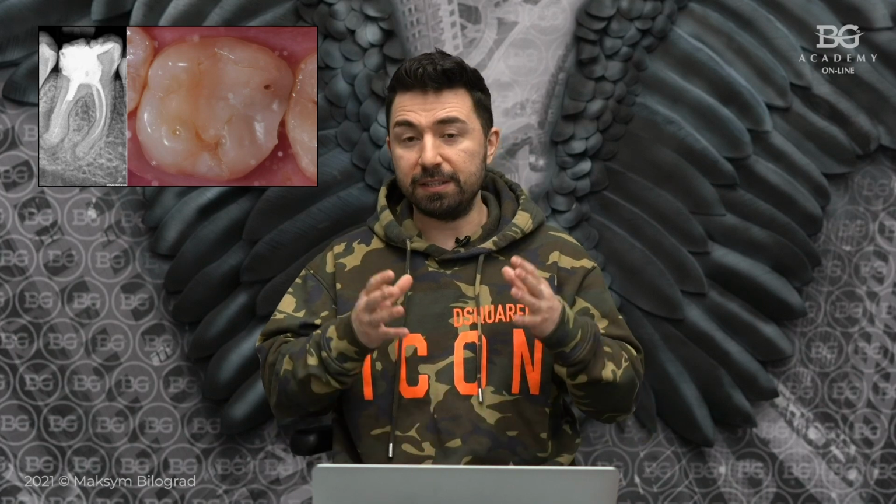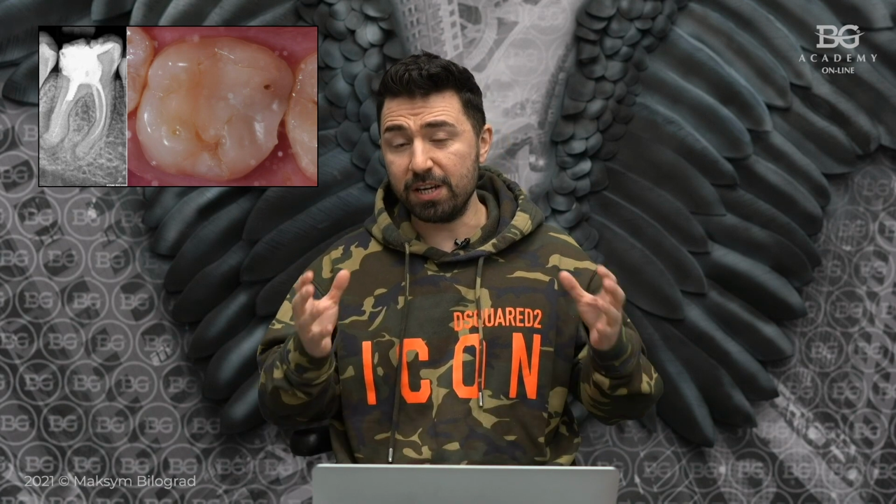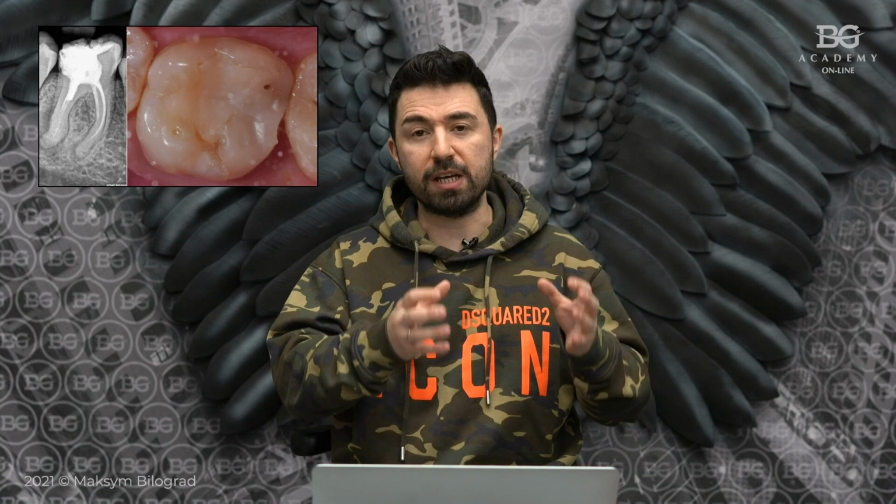Broken files, deep defect, periapical destruction, indirect restoration. Very interesting, from endo to resto clinical case, special for you.